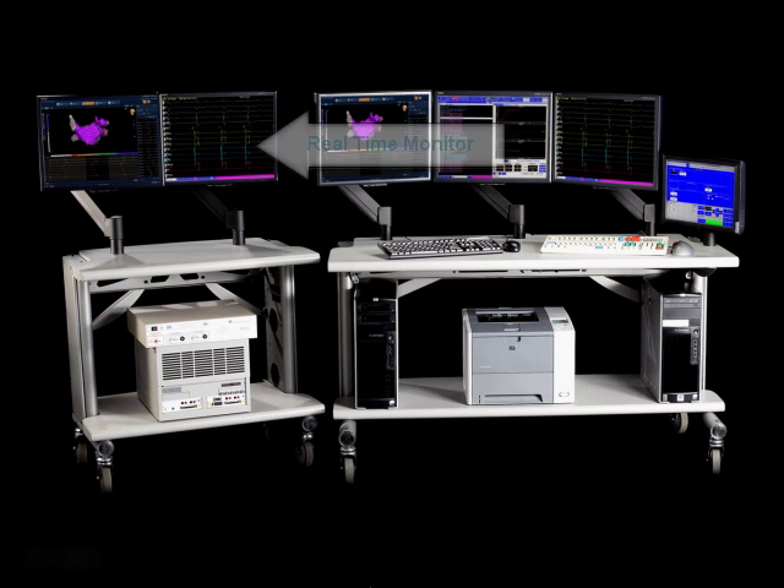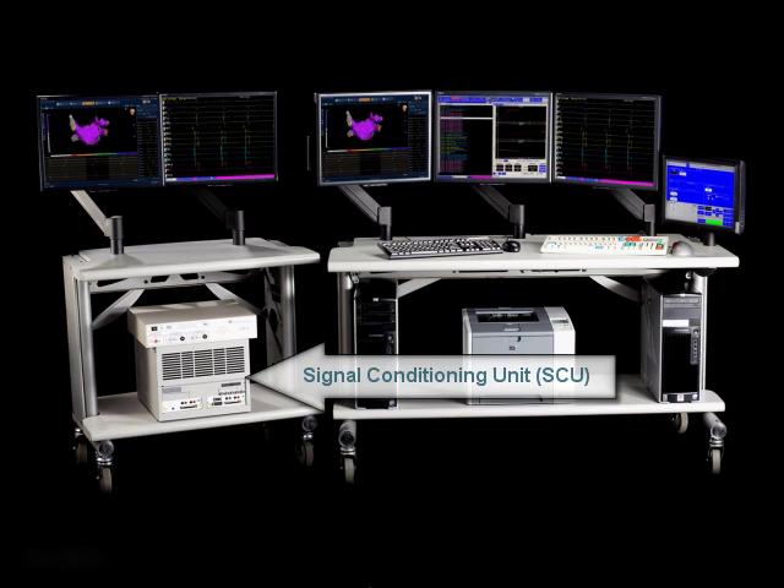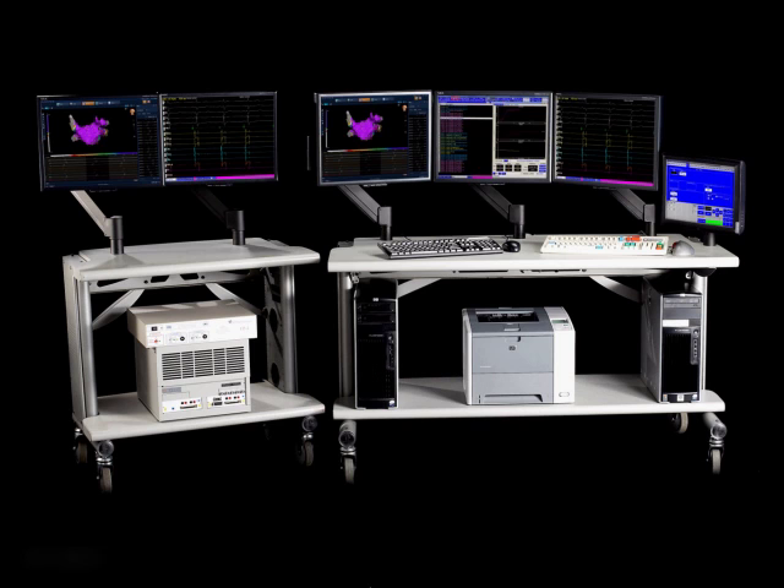The two main components of the EP Workmate System are the main computer and the signal conditioning unit. The signal conditioning unit is responsible for collecting all the surface and intracardiac signals, digitizing them and sending them to the main computer for display.